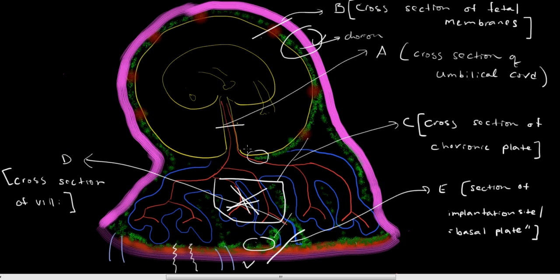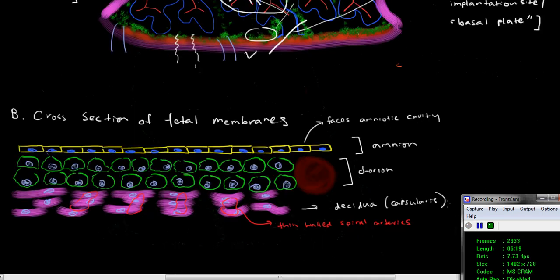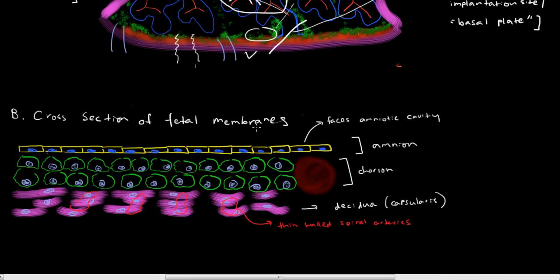And that's really the structure of the fetal membranes. But you actually can see embryological vestiges of these involuted villi, and that's what you see with these senescent villi. Senescent villi. So in other words, involuted villi. So then let's consider what the cross-section of the fetal membranes looks like. On top, pointing outwards towards the amniotic cavity, are your amniocytes or amniotic cells. And they are relatively organized, cuboidal to columnar cells. So they're basically low cuboidal to columnar cells, depending on how irritated they are.